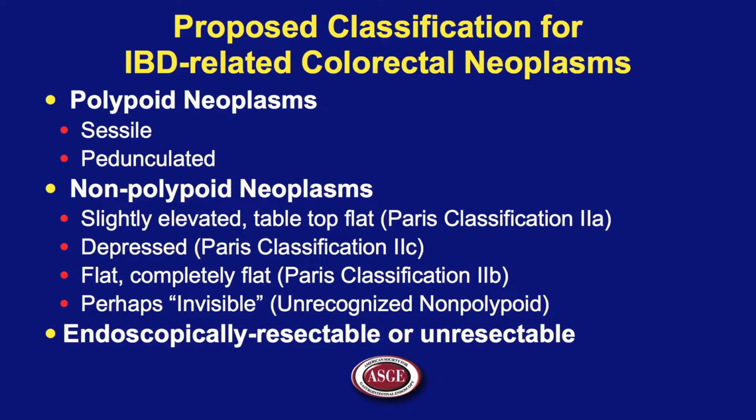Rather than using the terms adenoma-like or non-adenoma-like, we think it is clearer to describe lesions as endoscopically resectable or unresectable.